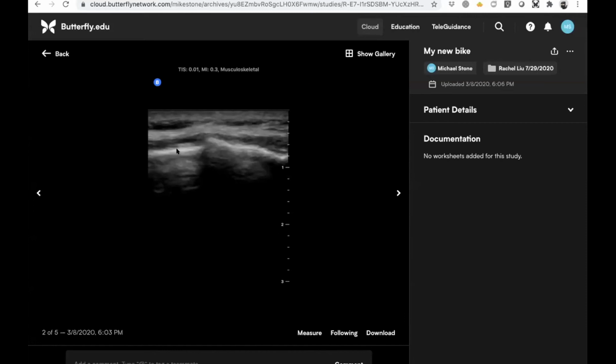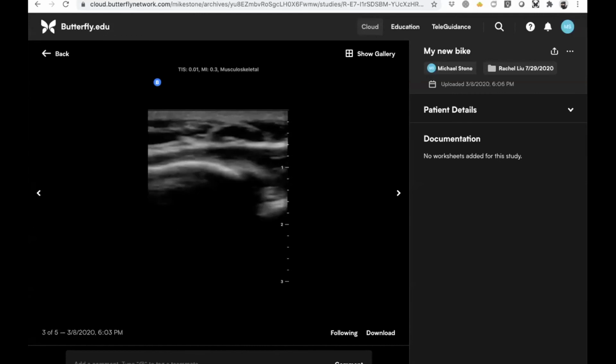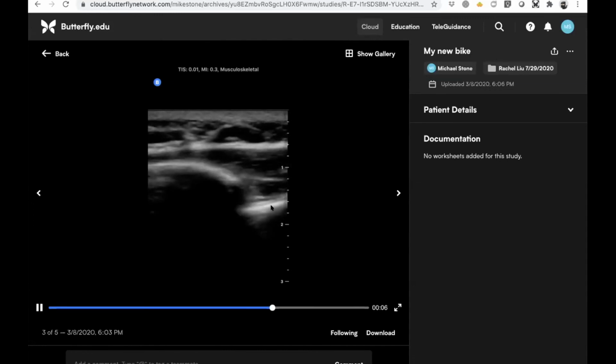So still image, and I'm looking at a lateral rib here. This one doesn't really require a whole lot of explanation. You see a nice smooth bony cortex, and then a step off, and then continuation of the bony cortex here. So this looked like a rib fracture in a still image, and then that's just looking at it in a mobile image with the lung sliding down here. So that's a good sign, but clearly a step off.